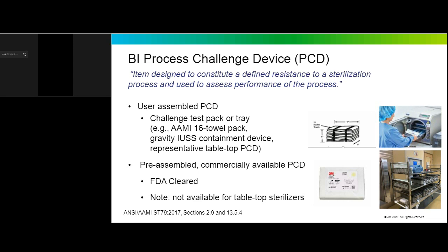As we mentioned earlier, those biological indicators are used within a process challenge device. So if you hear people talk about the term test pack or challenge pack or PCD, those are all synonyms for a process challenge device.